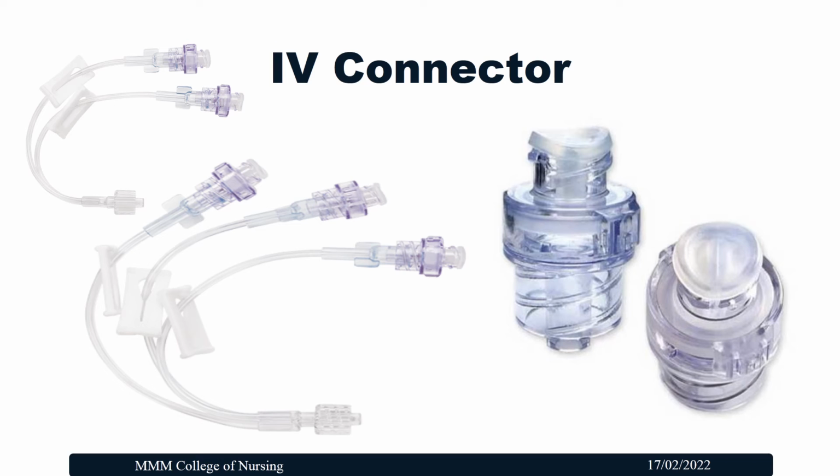Here we can see the IV connectors, which are available with 2-line or 3-line, facilitating multiple drug administration. At the tip there is a split septum device, which facilitates access to the Luer lock, or the syringe tip can be attached to it to administer the medication. So there is no need to use needles, and it facilitates a closed system of IV line.